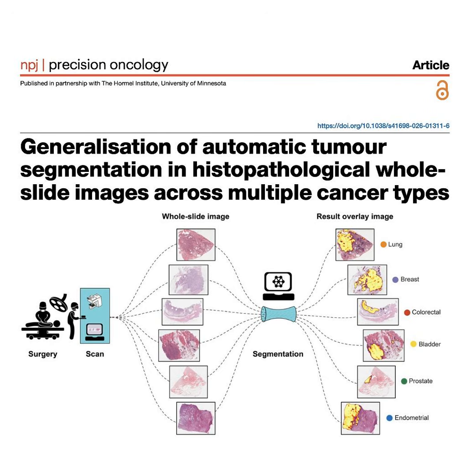Thank you. So they took this fully trained system, right? And unleashed it on independent validation datasets comprising over 3,000 new patients. Yes. And to really test the universal nature of the model, they threw a massive curveball at it. Breast cancer. Which is absolutely crucial because the AI had never seen a single breast cancer slide during its entire training phase. Not one. Its diet was strictly colorectal, endometrial, lung, and prostate. And yet, when faced with an entirely unseen organ, it achieved a Dice similarity coefficient, or DSC, of over 80%.